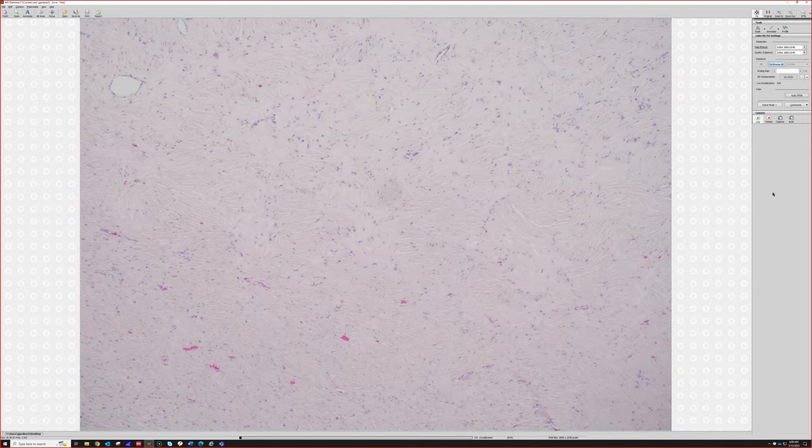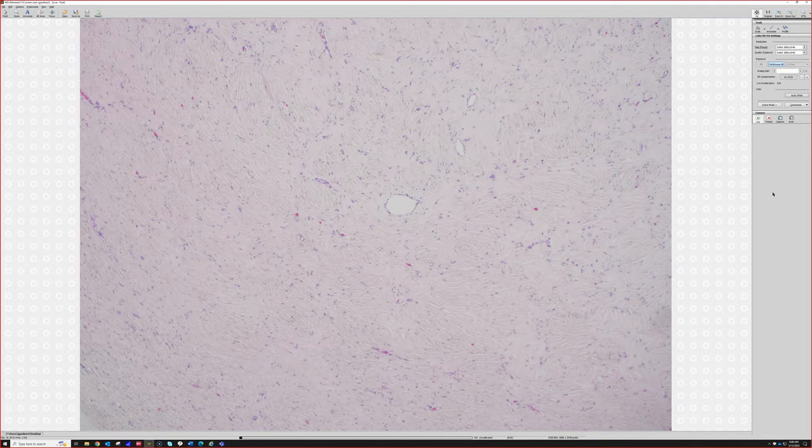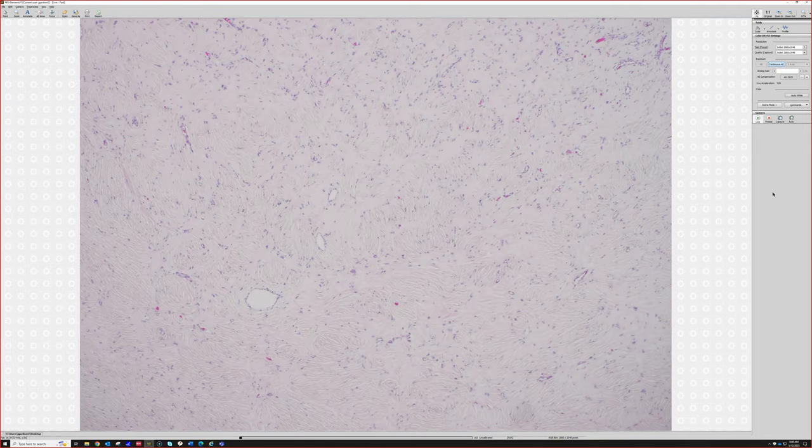The neurofibromas could look like this, but tend to be a bit more cellular and not quite as sclerotic. Sometimes it's a little hard on a light microscope projection like this to get the feel of whether the collagen is really sclerotic or pale because it's got some myxoid change. This one's a little bit faded too, or the H&E wasn't as strong. One other thought would be perineurioma because it's swirling and whirling. So you could easily do perineurial markers. Some perineuriomas can become quite sclerotic and look like this. So that'd be another thing.